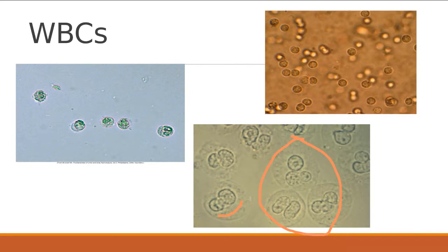That's why I said when you talk about casts, remember if you call white blood cell casts, it's clinically significant. So you're making sure it's not actually just a bunch of white cells touching. Like you can see, these are just touching, but this isn't a good clump picture, but you'll see clumps when we're in lab.